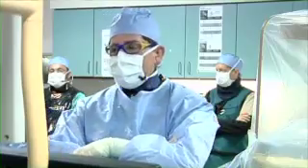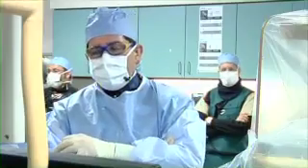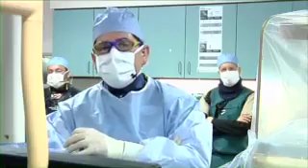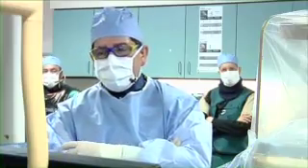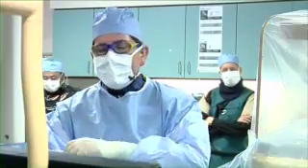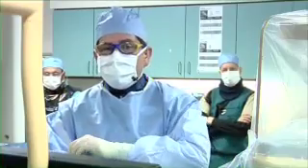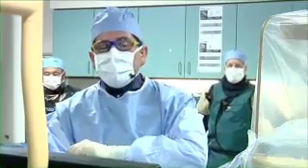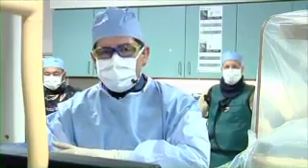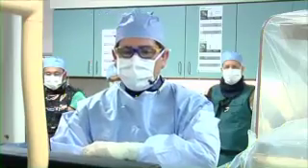They're not approved in the United States. They're investigational. One is made out of pig intestinal mucosa that is approved for plastic surgery. They use it in burn patients. So instead of having the disc, they have this cover that is biodegradable. And there's another device that's totally experimental, also completely 100% bioabsorbable. So the device will disappear with time, in approximately 6 months to a year. But those are not approved. They're far away from being in clinical trials in the U.S.